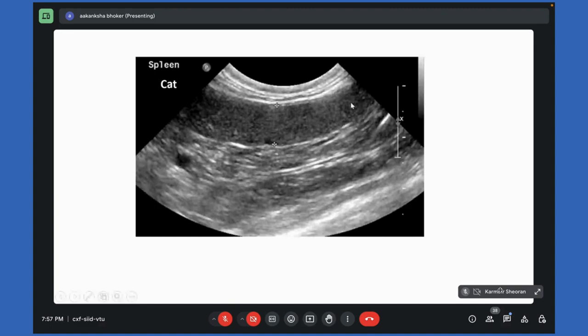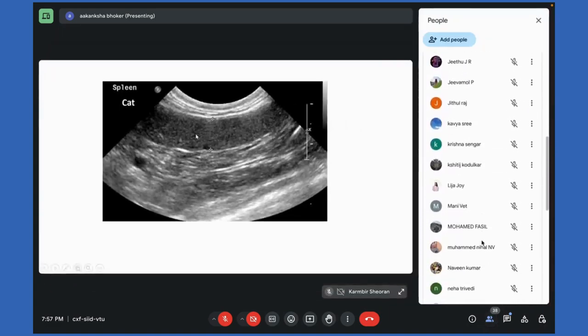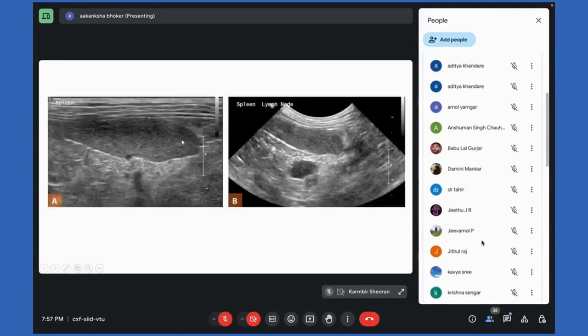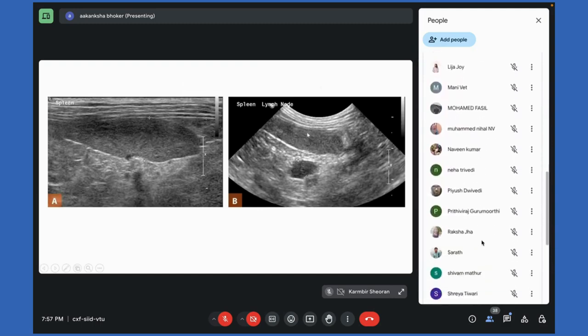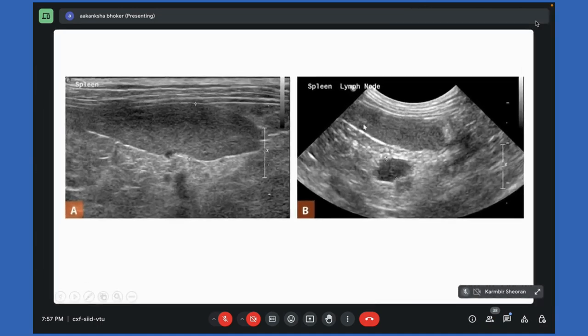However, for a cat, we can see most of the spleen in one scan, and the width will generally be less than 1 centimeter. The length will be somewhere around 3 to 4. Now this picture shows that when we were using a low frequency transducer, the spleen appeared very fine. This is the fine echotexture of the spleen. But when we switched to a high frequency transducer, which has somewhat better resolution, the echotexture changed. It is appearing coarse.